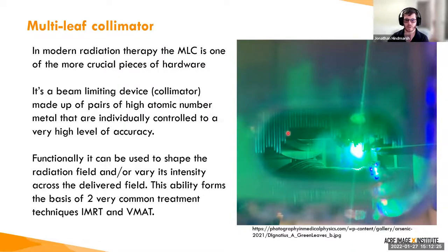It's used greatly within many of the modern treatment techniques, such as IMRT, intensity modulated radiation therapy, and volumetric modulated arc therapy, VMAT, because we can shape the beam and the leaves can move during treatment. It's pairs of a high atomic number metal that are individually controlled.